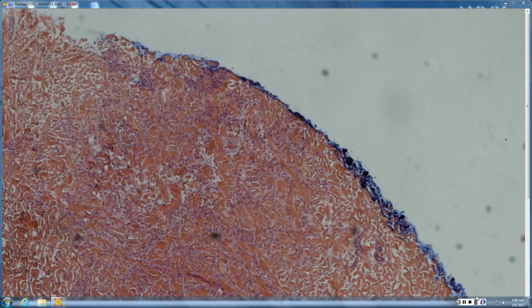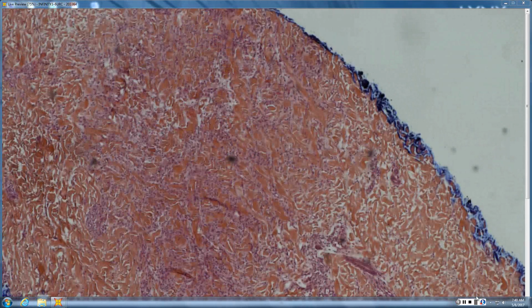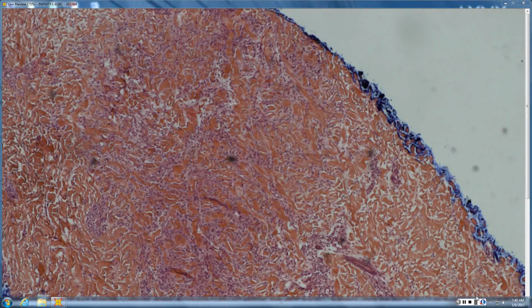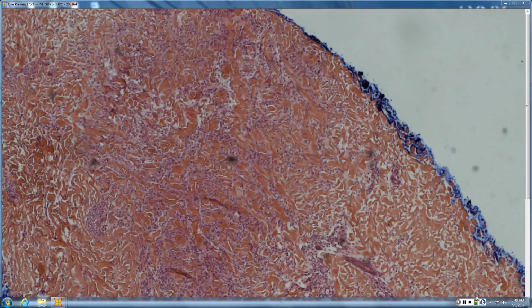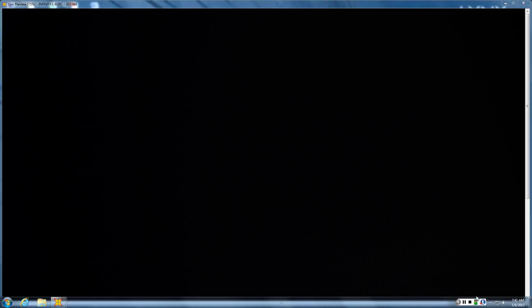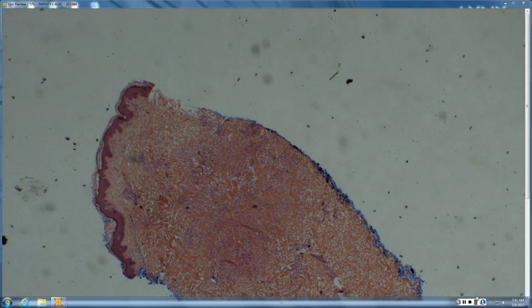So it looks like, it almost looked like a DF in a way with the collagen trapping, but I think it's more like a sort of granulomatous infiltrate, or at least interstitial. So certainly an interstitial busy dermis, so things you would think of include granuloma annulare, DF, things like that.